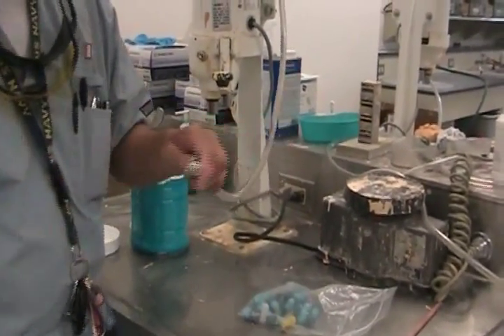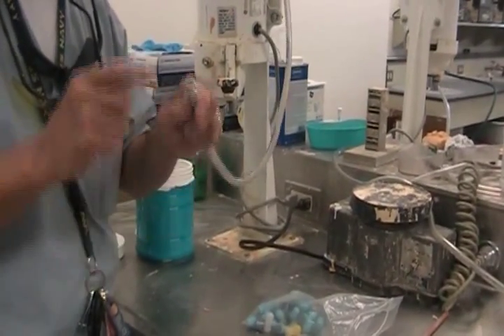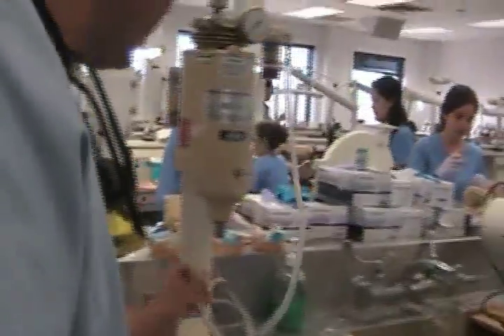Every time you leave the lab with your own hose, you want to make sure it's clean. I've checked my equipment, got all my materials, did all my measurements before I even started in here.